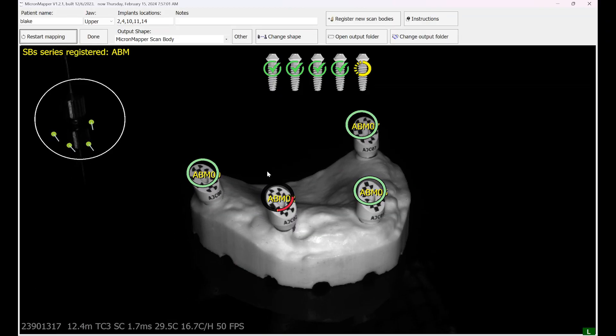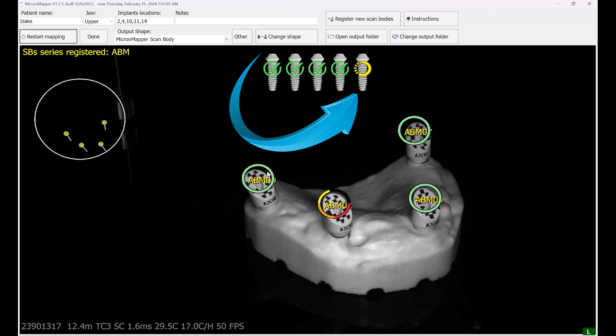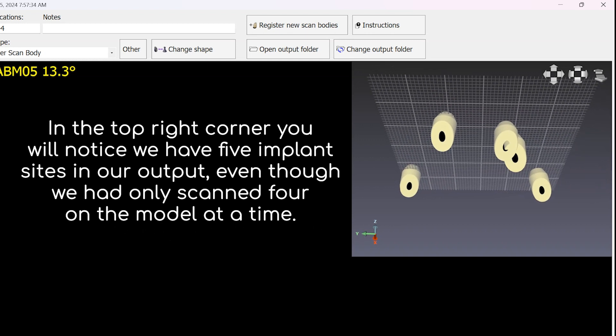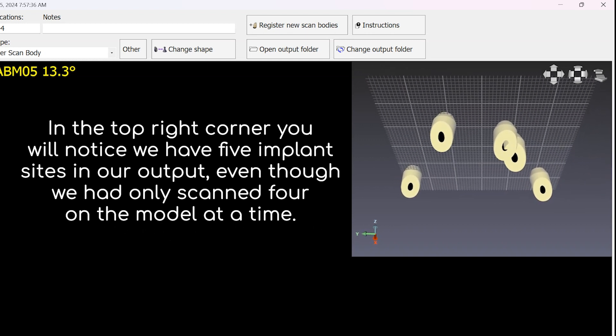We will then pick up the Micron Mapper and continue scanning. You will notice the Micron Mapper adding in that fifth implant site, and the scan will complete. In the top right-hand corner, you will notice that we have five implant sites in our output, even though we had only scanned four on the model at this time.